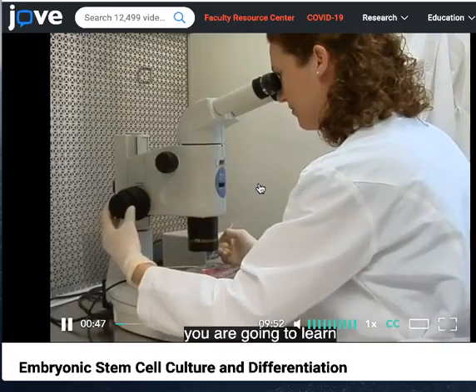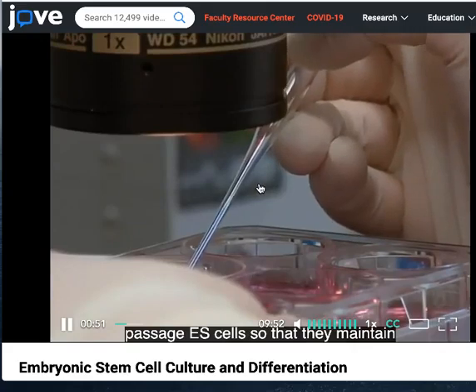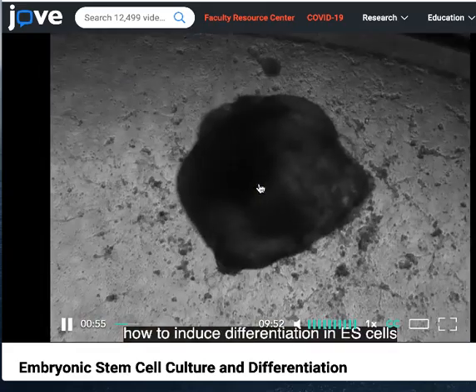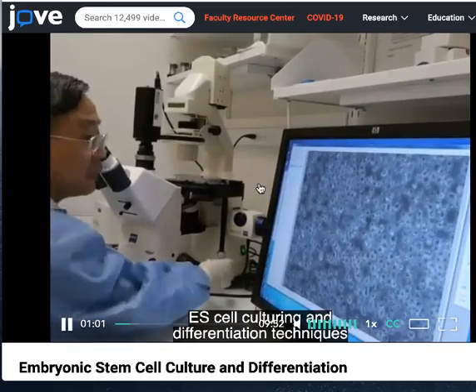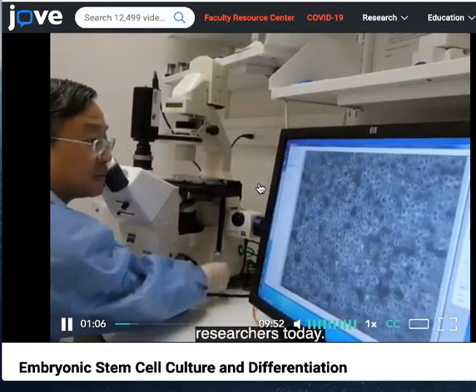In this video, you are going to learn how to culture and passage ES cells so that they maintain their unique properties, how to induce differentiation in ES cells to form specific cell types, and the ways in which ES cell culturing and differentiation techniques are being used and refined by researchers today.